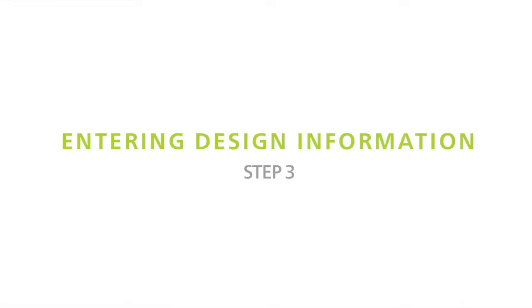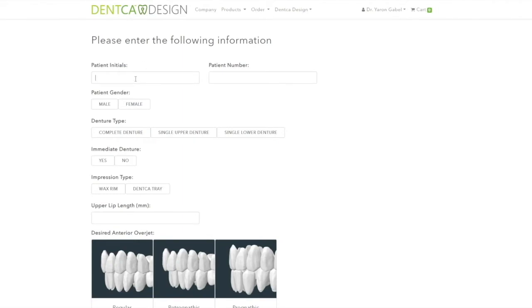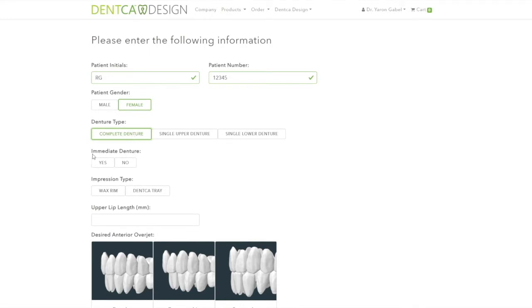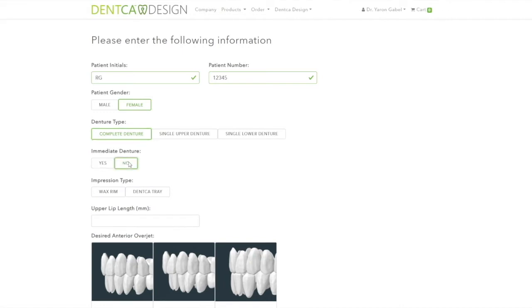Entering Design Information. On this screen, you will enter patient information and select each option that best suits your design needs. If you will be designing an immediate denture case, please select the immediate denture function on the information screen and ensure your scanned files are uploaded with the teeth still present. A function a few steps ahead will allow us to remove the teeth we plan to extract. If you already removed the teeth from the model and do not require removing them with the software, it is not necessary to select the immediate denture option.